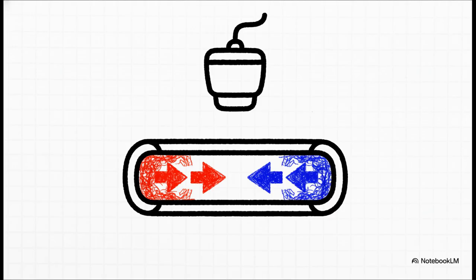It's actually not as complicated as it looks. At its core, Doppler just measures blood flow. The color coding is really simple. Just remember BART, blue away, red towards the probe. By looking at the blood flow patterns in vessels like the umbilical artery, we can get a great idea of how well the placenta is working and how well the baby is being oxygenated.